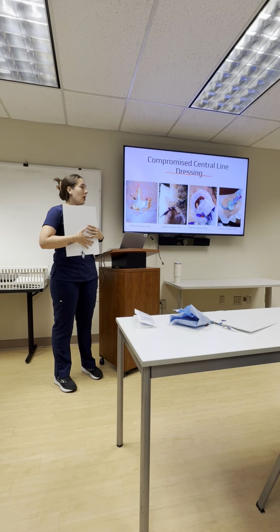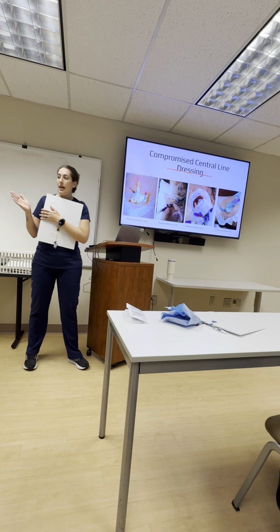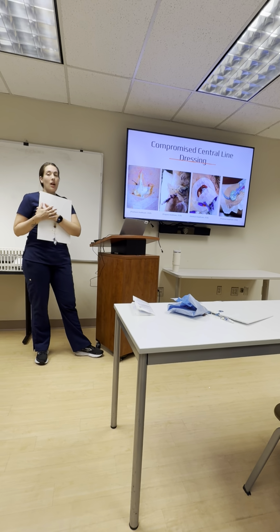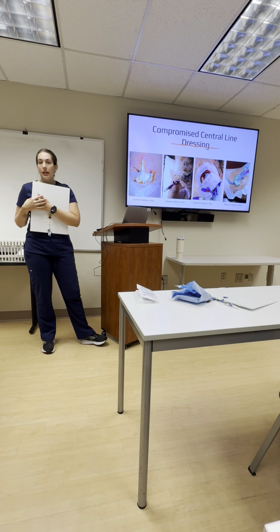And this is probably the most common situation you'll see: the dressing lifting. A lot of the time people will just keep putting Tegaderm on it, but that dressing is compromised. We shouldn't be putting just Tegaderm over it, we should be changing the entire dressing out.